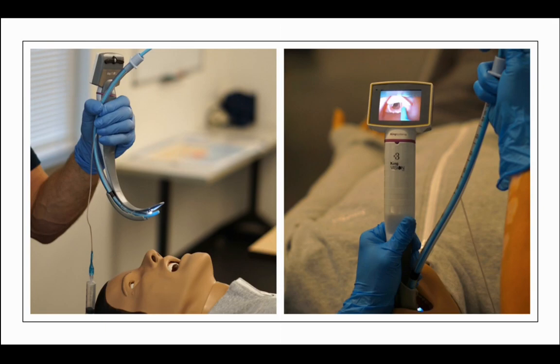So the only time I'm using a bougie with the video scope is if it is a standard Mac geometry video scope, like the McGrath, or it's a channeled device like we see here, the King Vision. So within the channel, you can put the ET tube in the channel, loop it really good, and then you can put the bougie inside of there, but make sure the bougie extends just a little bit so that it doesn't stick out in front of the tip, but it's outside the channel.